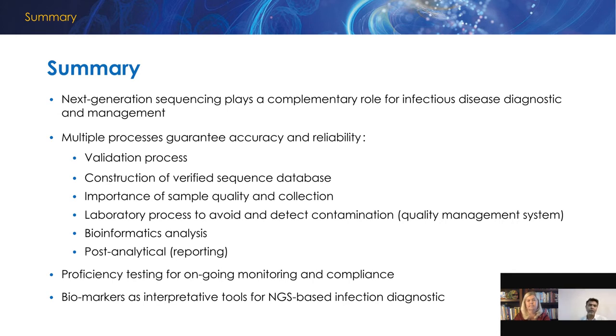So the way to eliminate possible inclusion of contaminants during the process is having a robust, strong quality control process and surveillance during the whole analytical, pre-analytical and post-analytical phases. But to avoid introducing contaminants during the collection, the laboratory should be able to provide education, training, and especially a collection protocol to providers to minimize the risk of contaminants or inclusion of sometimes just colonizing organisms. Thank you so much.